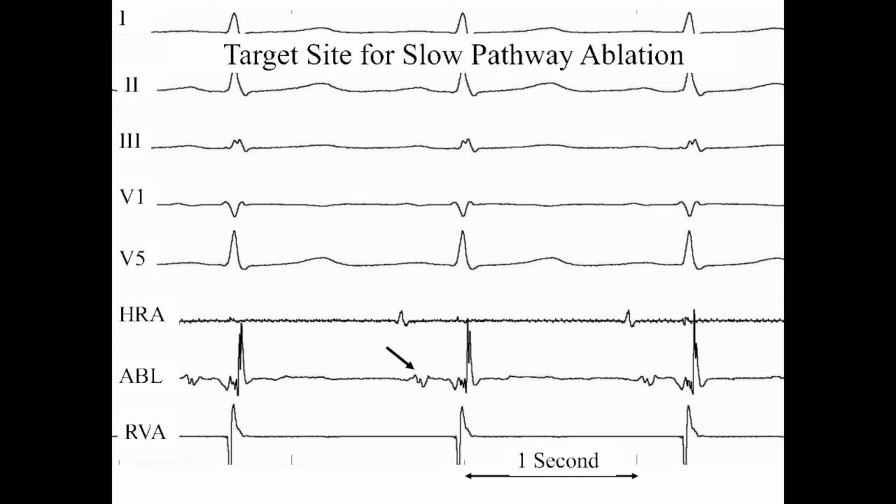You'll want a nice fractionated atrial electrogram and a large ventricular signal. You need a large, crisp V signal as an indication of good contact. And remember, because the tricuspid valve is a little bit displaced relative to the mitral valve, that ventricular recording that you're getting is really the left ventricle. And this is the fractionated electrogram that's probably due to slow conduction over that slow pathway during sinus rhythm. People talk about slow pathway potentials. You know, for typical AV nodal reentry, though, you don't see anything other than this highly fractionated electrogram.